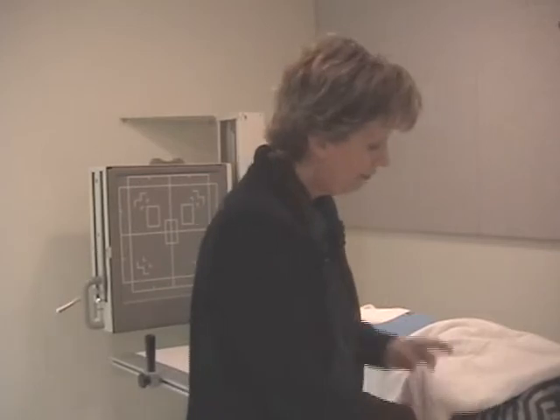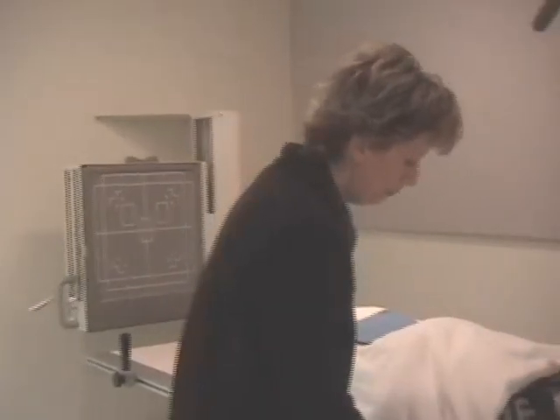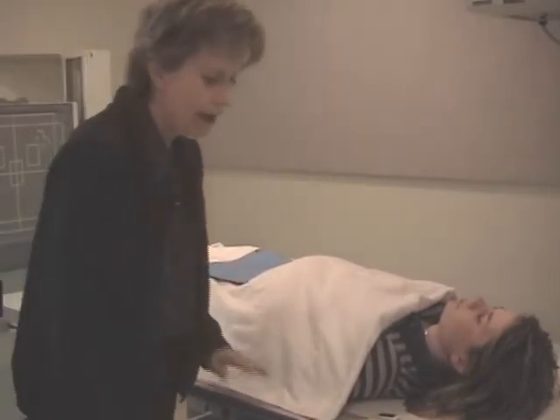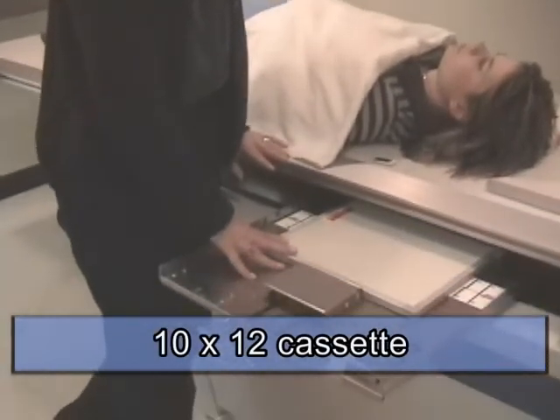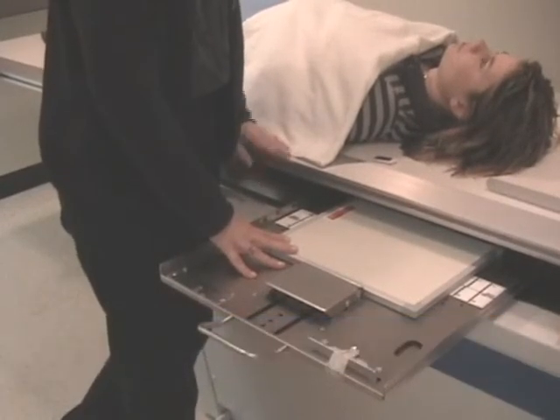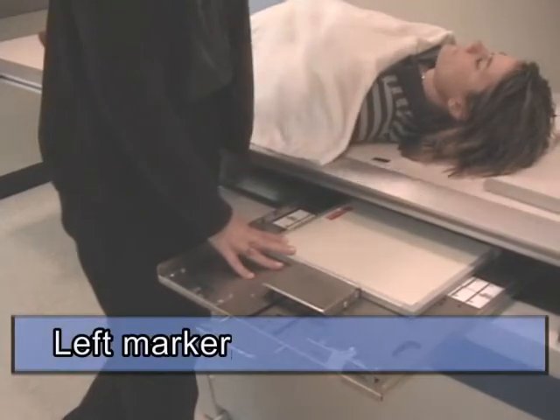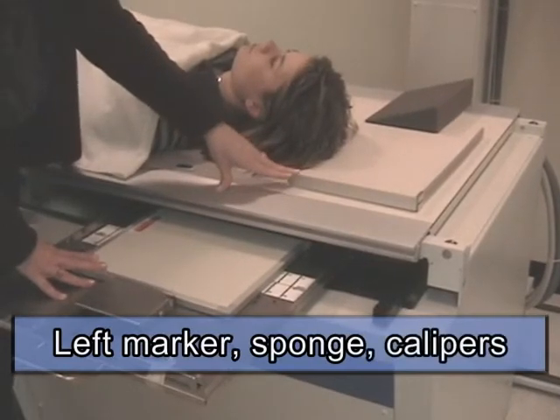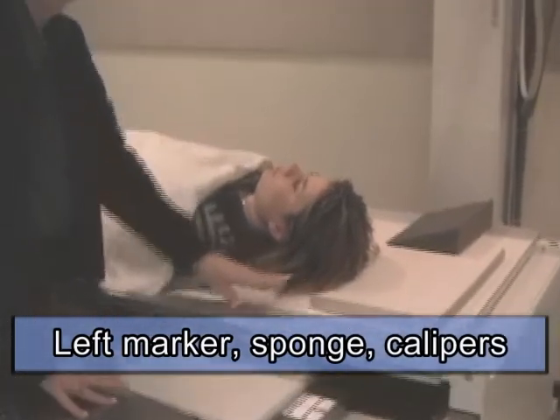So we're going to focus now on our patient. We actually have a patient who's cold, so we put a blanket over her and protected her reproductive organs. I have a 10 by 12 cassette in the Bucky tray with the ID towards the caudal end of the table. Supplies I have out will be my left marker, a sponge in case I need it, and calipers, which are a good trick for beginning students to have available. I have my tube transversely centered, and I have 40 inches to the Bucky tray as preliminary setup here.